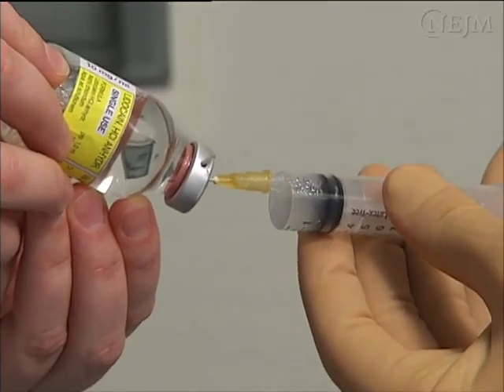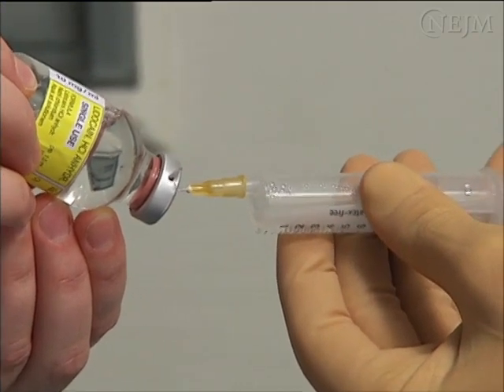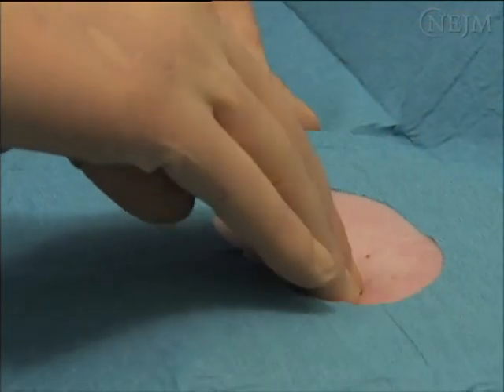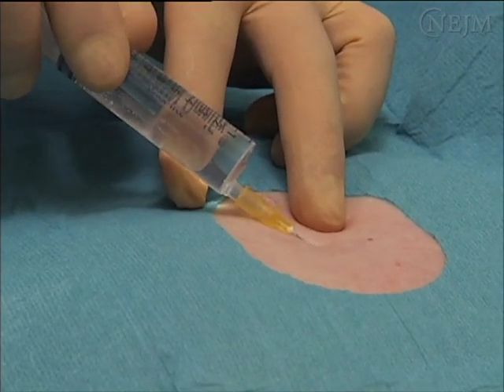Aspirate lidocaine into the 10 ml syringe for use as a local anesthetic agent. Using a 25-gauge needle, inject a wheal of lidocaine at the superior edge of the third rib at the mid-clavicular line.